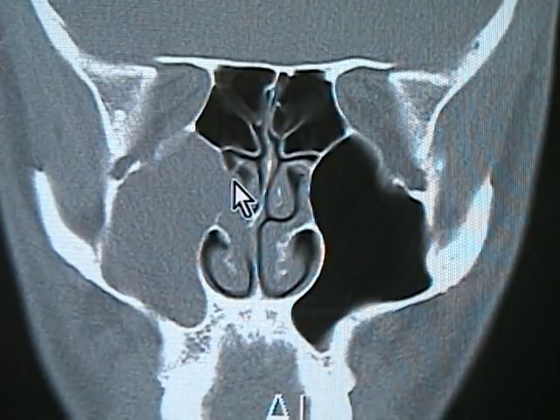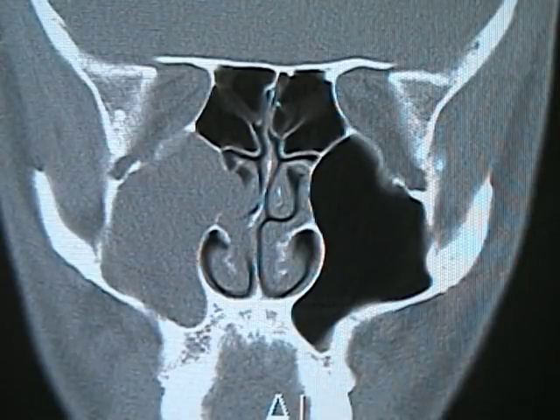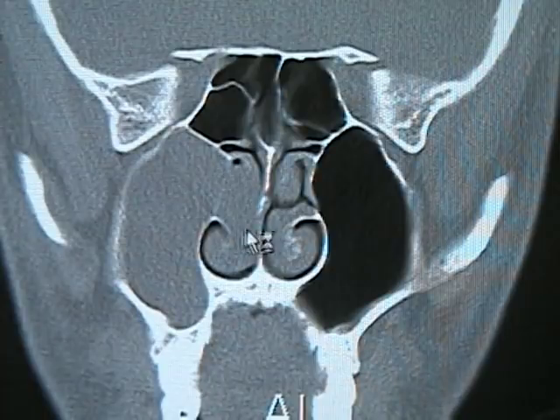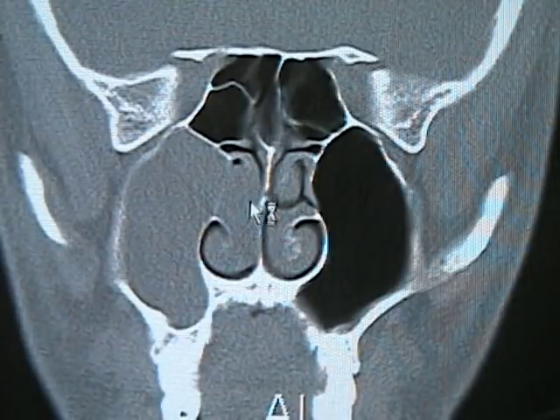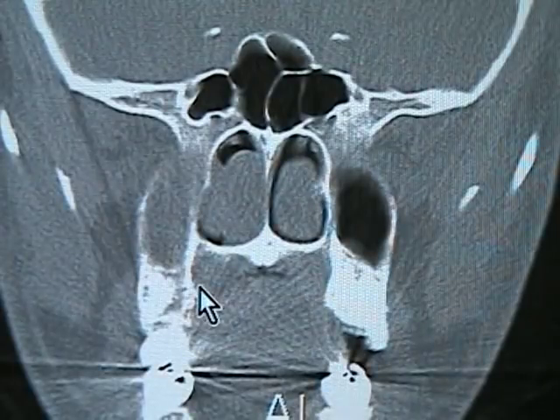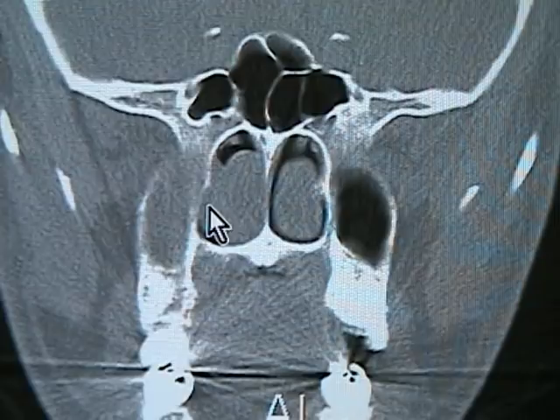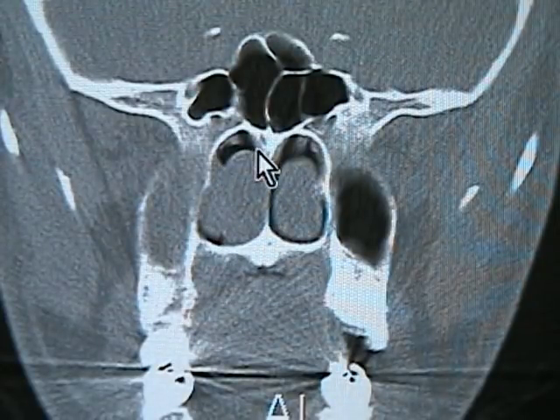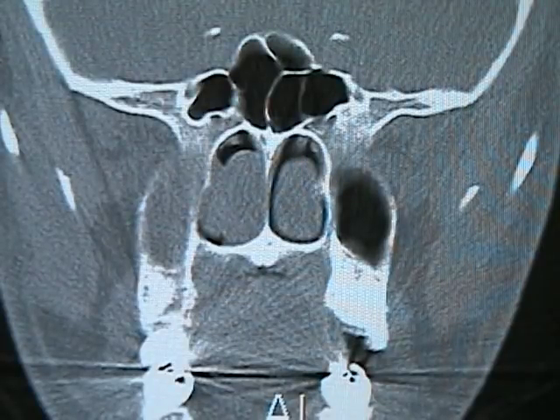We can now see what appears to be the extension of a polyp or soft tissue mass from the left maxillary antrum in the region of the posterior fontanelle passing into the middle meatus. The choanal polyp is filling the middle meatus and appears morphologically to blend in with the inferior turbinate, although in actual fact it has no relationship whatsoever with the inferior turbinate. In its most posterior extent it's very difficult to identify which soft tissue mass in the choana is inferior turbinate and which is choanal polyp.